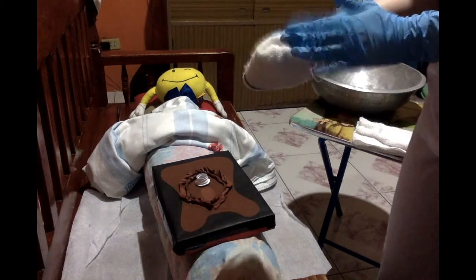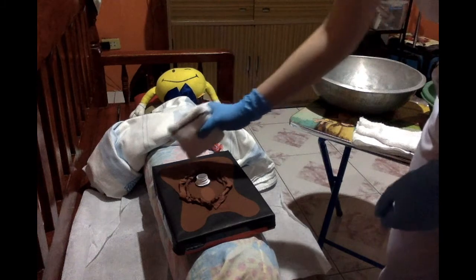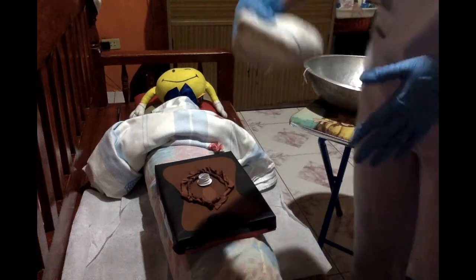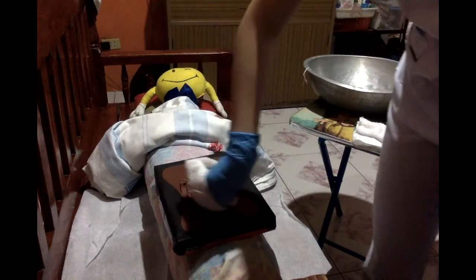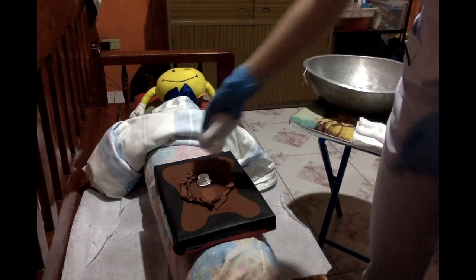So the first side, I will use it in wiping this part, like this. Remember to wipe it or wash it from front to back. Then the second side, I will use it in this part. And the third side, I will use it here.